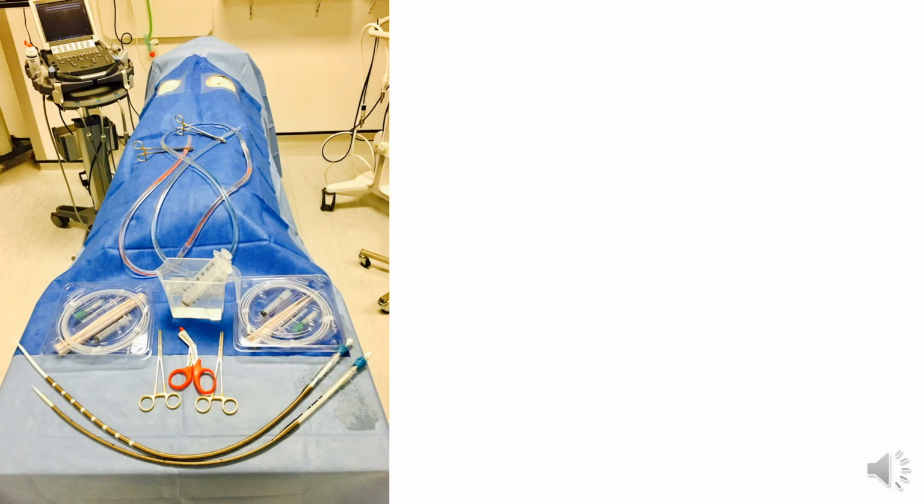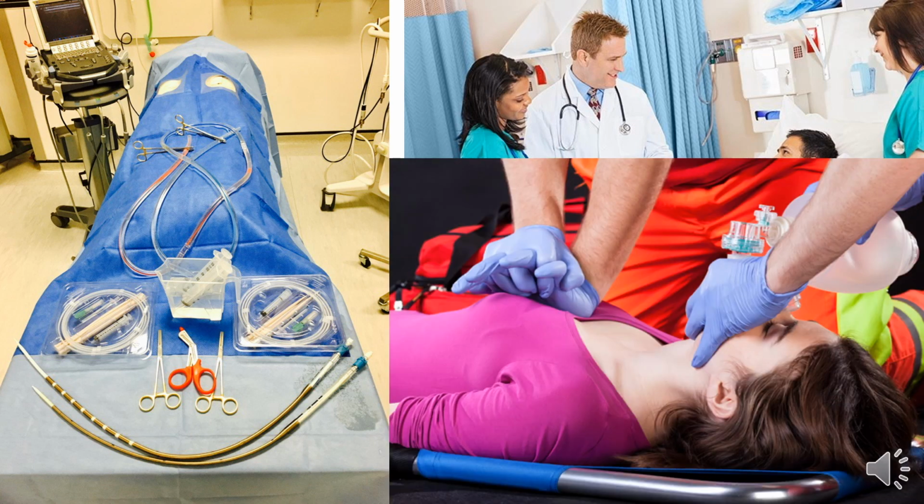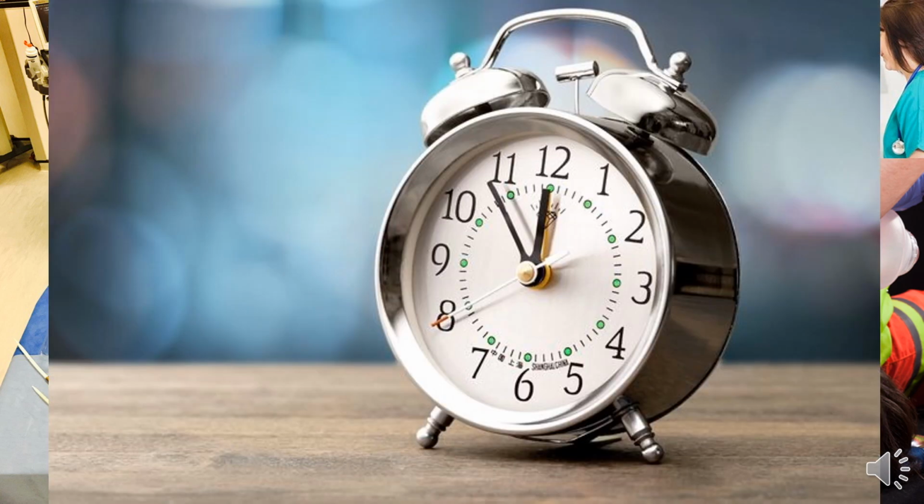We're choosing the right patient. We're looking back at the selection criteria, the exclusion criteria, and seeing who fits the right criteria for pre-hospital cardiac arrest and ECMO. High quality CPR. Some of these studies only include mechanical CPR. We are not going to do that. But we do need high quality CPR, whether it's mechanical or it's manual.